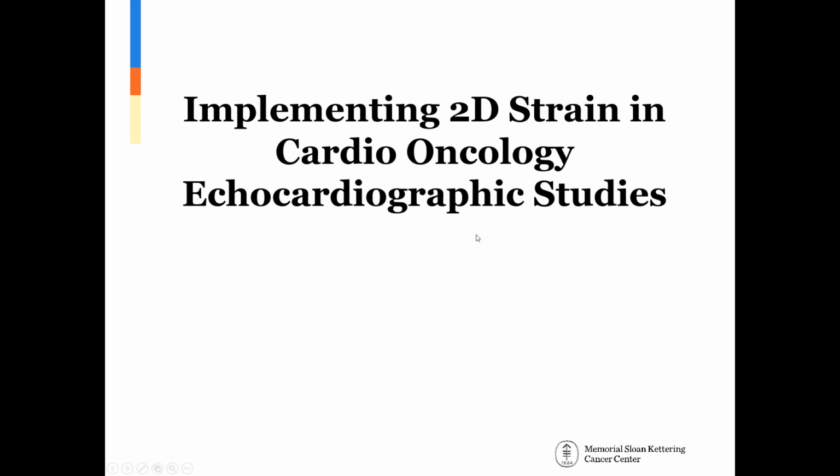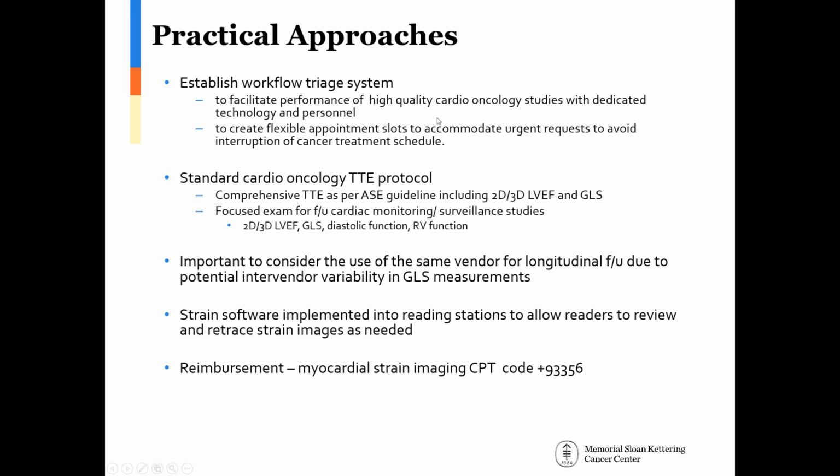So the last few slides, I just want to sum up what we discussed, the practical guidance on the clinical implementation of strain in the cardio-oncology lab. As a first step, it's really important to establish a workflow system that will allow the performance of high quality cardio-oncology studies with dedicated technology and personnel.